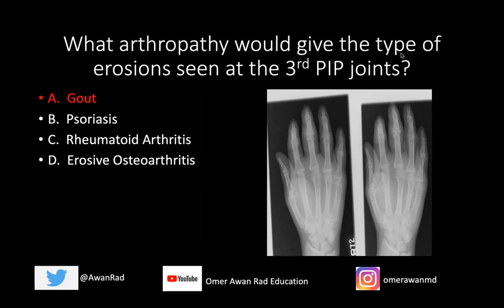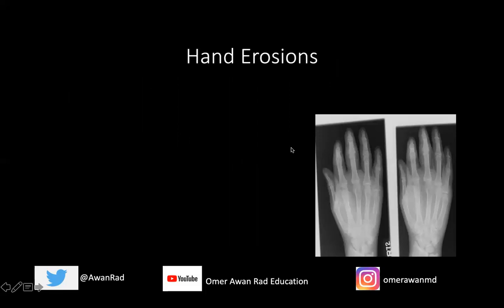What we're seeing here are juxta-articular erosions — erosions that are not really in the joint space, but just around or outside the joint space. They're very well marginated, really well-defined — a nice appearance for what gouty arthropathy would look like.